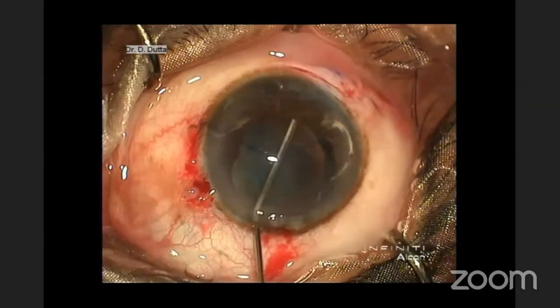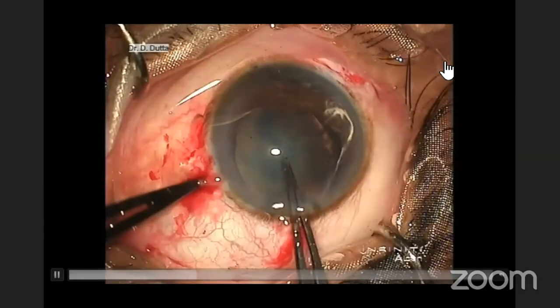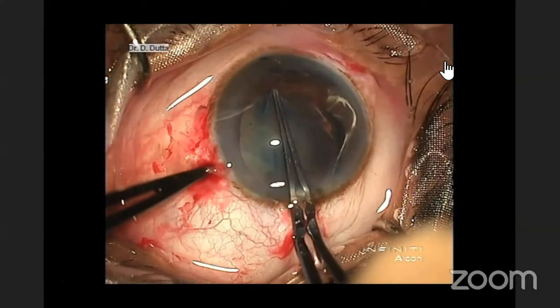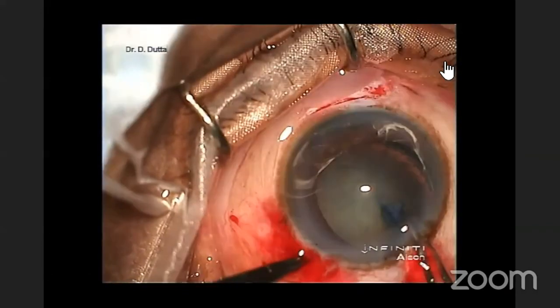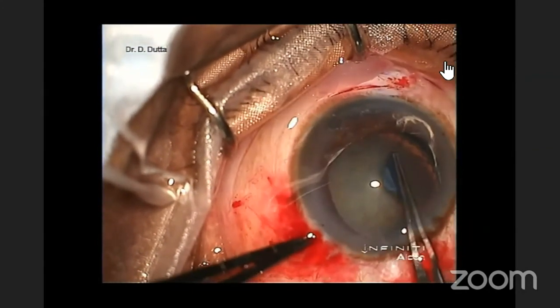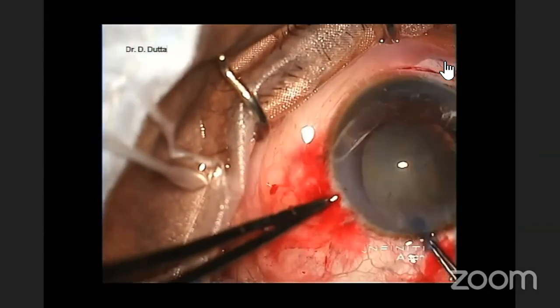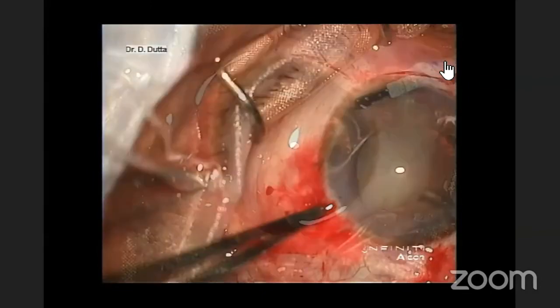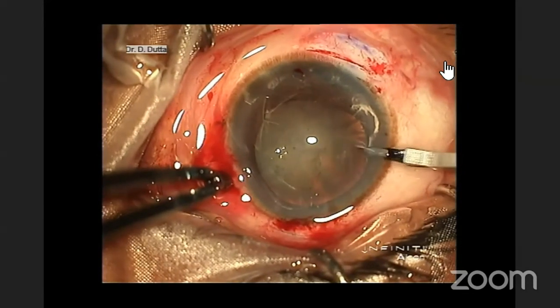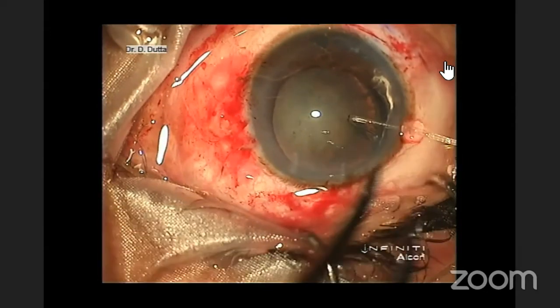I plug the prolapsed vitreous with cohesive viscoelastics. Now I remove your anterior capsule carefully. Two stab incisions are made adjoining the area of dialysis. I have fixed the unsupported portion of the capsular bag temporarily with capsular hooks.